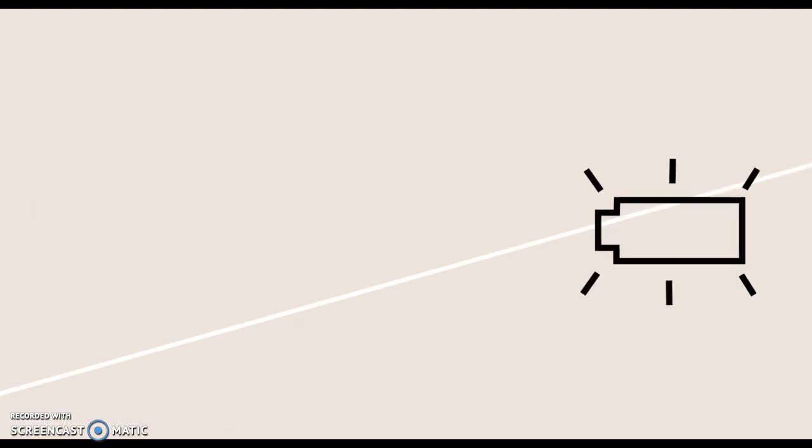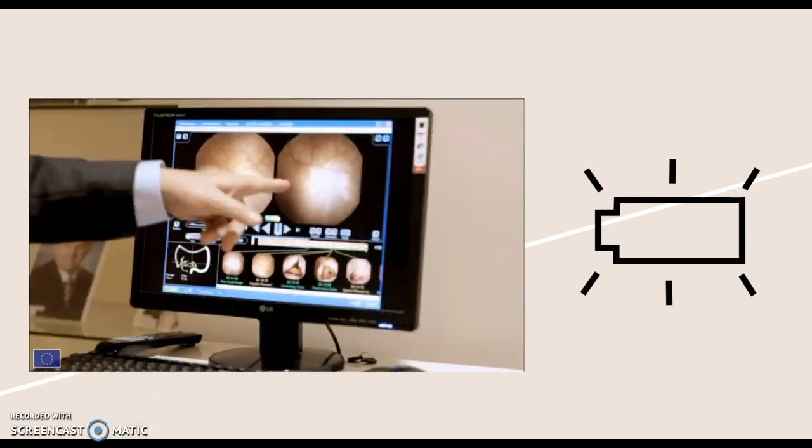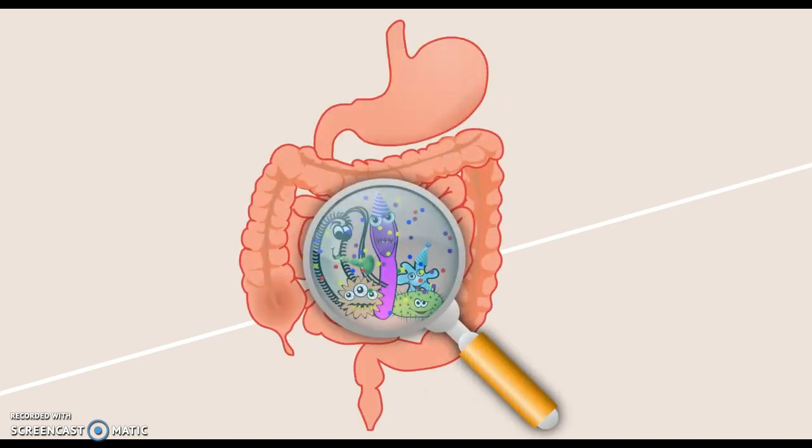The procedure is completed after about 8 hours or when the pill naturally passes through the body. The pill is made so it can be flushed down the toilet. The battery life of the pill is about 10 hours, Darrow confirms. The images captured are able to be put on the internet to be analyzed by trained personnel anywhere in the world. Capsule endoscopy costs less than traditional methods used for this type of exam, ranging around $500 compared to the $800 to $4,000 other procedures of this type range from.